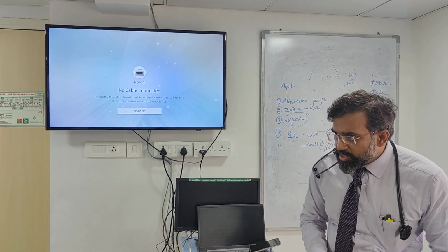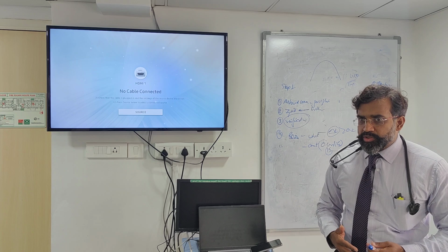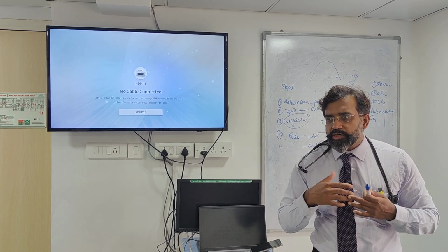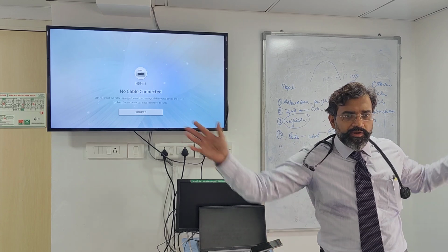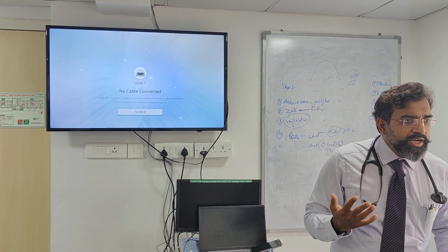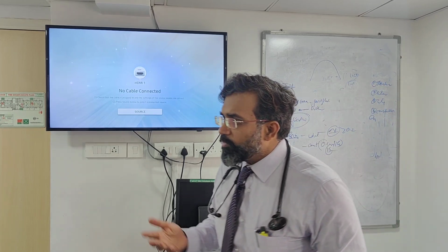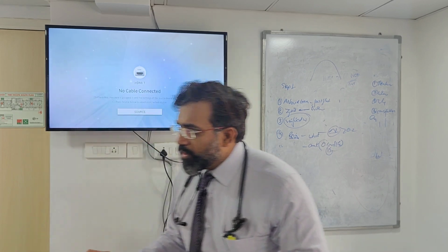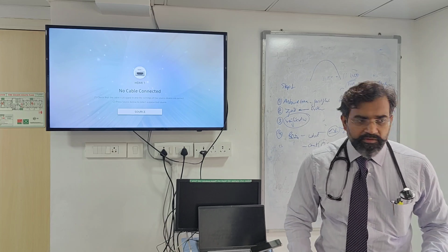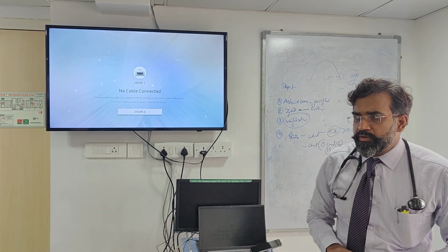Why? Because sometimes you may not get that temperature decay. That means delta T will be less than 0.2. The temperature decay is not there and the cardiac output trace is not coming properly. So then what I need to do is increase my volume. You understand? I may want to give 30 ml, because the more the volume, the more it will detect. Isn't it? But if I want to give 30 ml, I put 30 ml there.